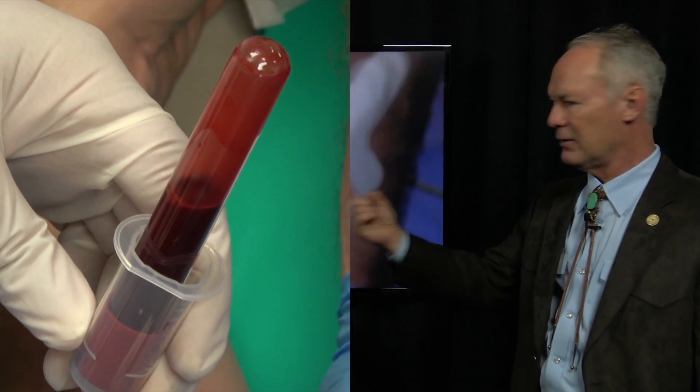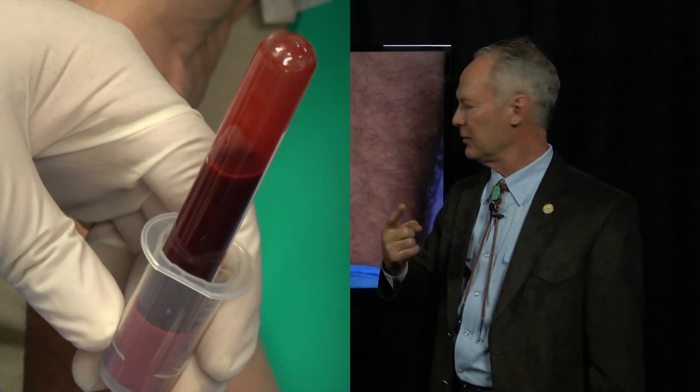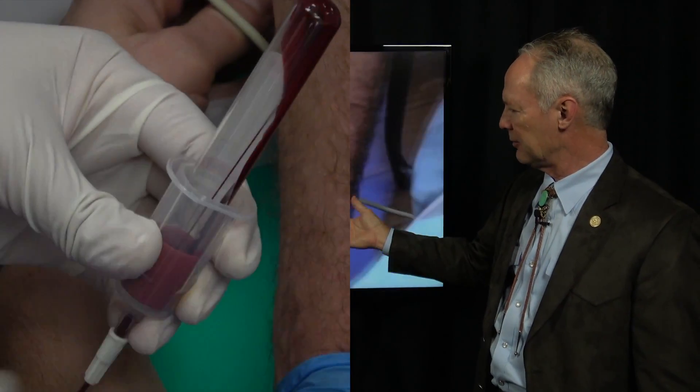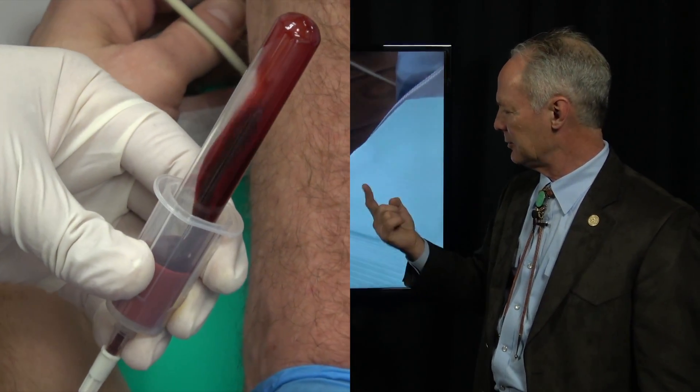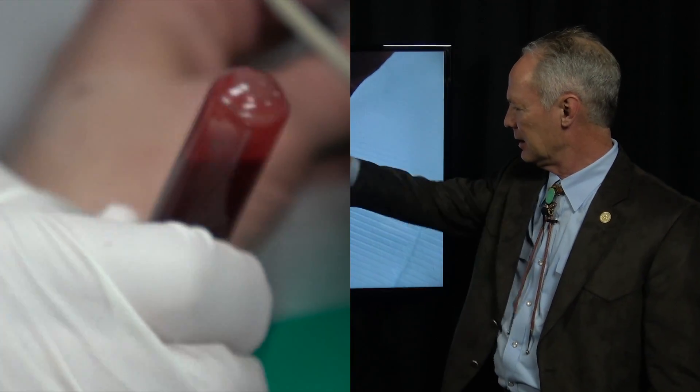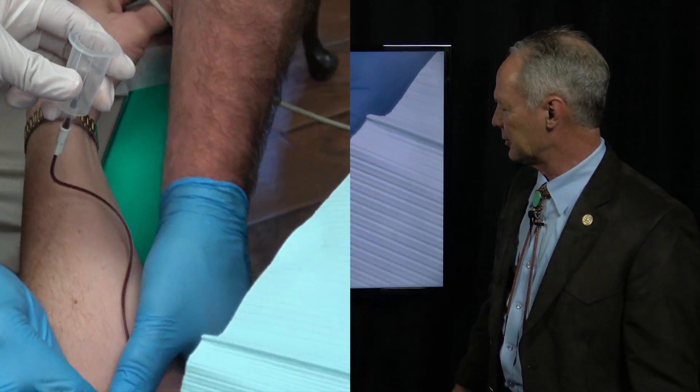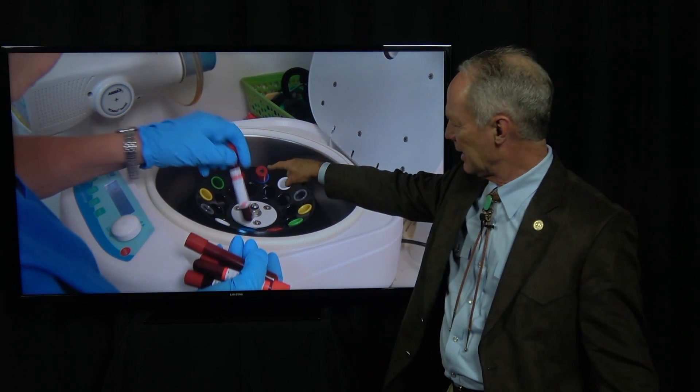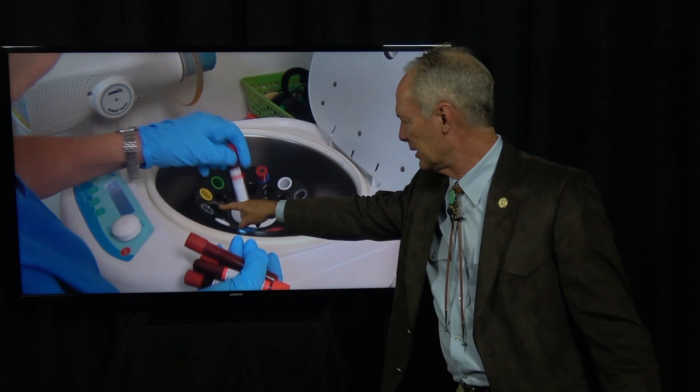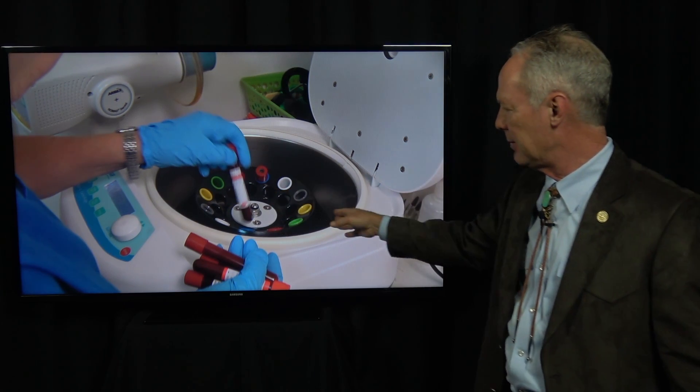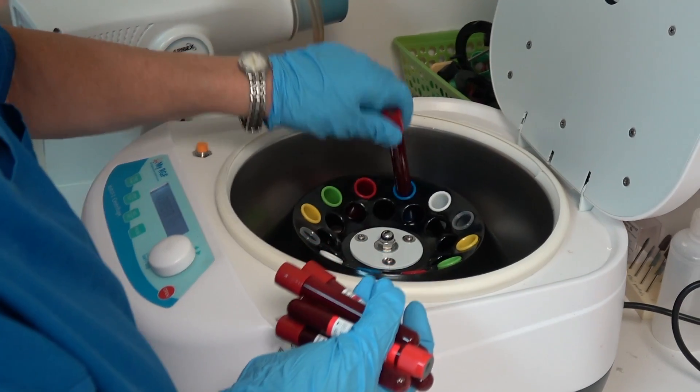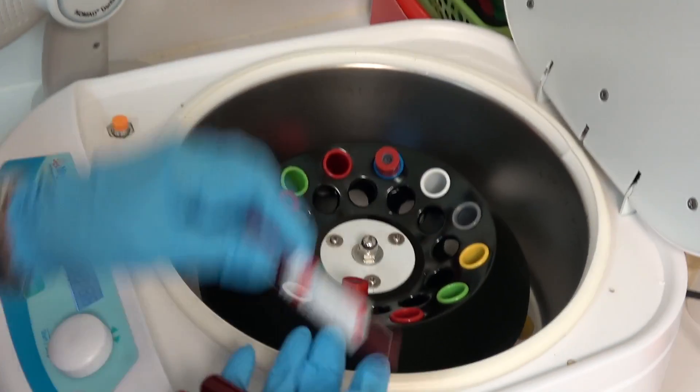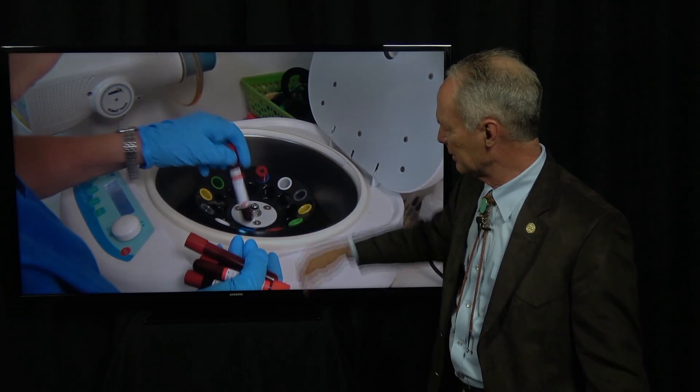You want to have an even number of vials. If you don't, you need to have an extra vial in the centrifuge, because there needs to be a balance with these vials. I'll show you that in just a minute. You put them in the centrifuge, so if there's a vial here, there needs to be a vial here. It needs to be balanced. So if for some reason you only drew an odd number of vials, you should put another vial on the other side.